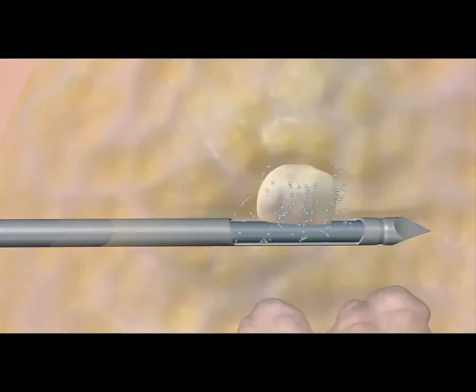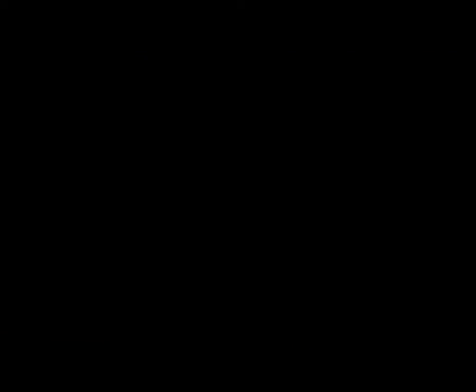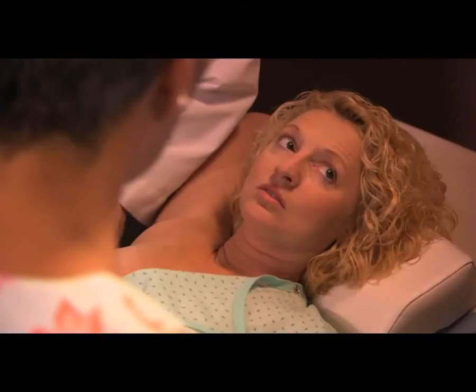The biopsy device will be inserted one time, and the doctor will rotate the device to take multiple tissue samples. It may take a minute or two to get the complete sample.